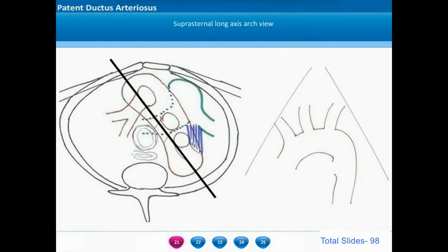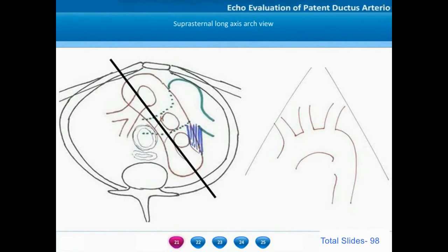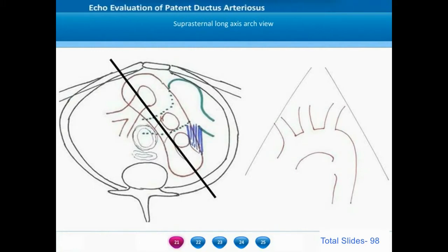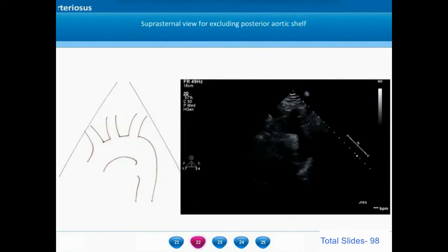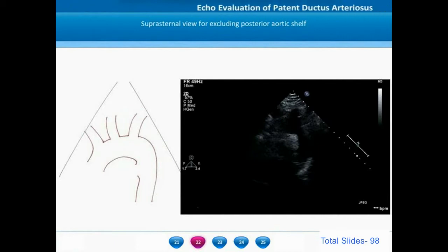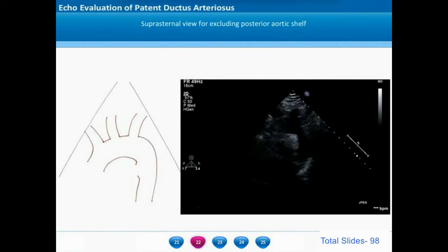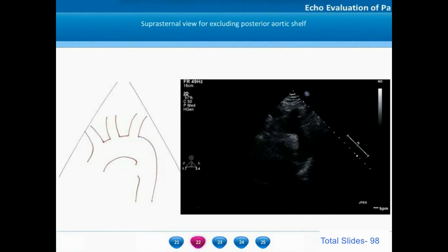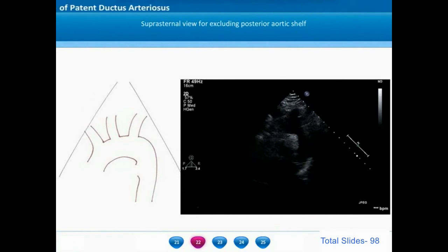We start by visualizing the aortic arch in its long axis by keeping the probe slightly oblique in the suprasternal window, showing the whole aortic arch from ascending to descending aorta and all the arch branches. On this suprasternal view of the aortic arch long axis, we can identify the whole arch and the arch vessels. This view is primarily used for excluding a posterior aortic shelf. If a patient with ductus arteriosus also has a posterior aortic shelf or a substrate for coarctation, it is best identified in this view.